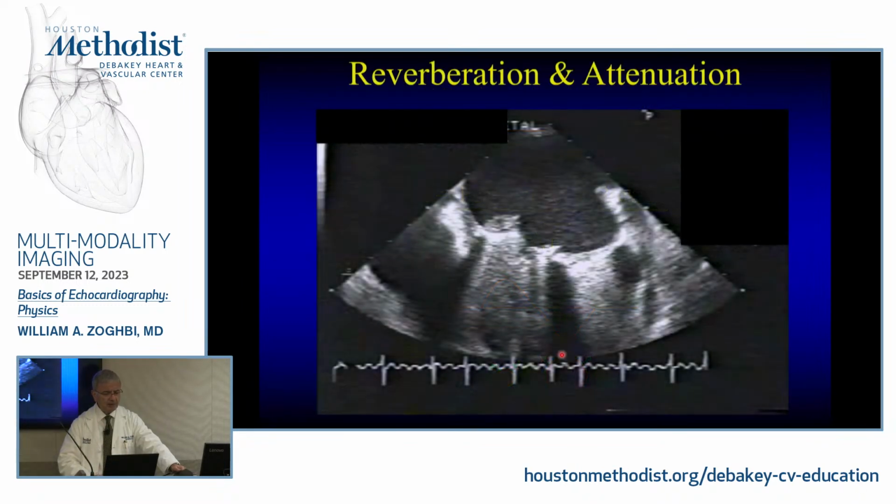contrast is. Now, we talked about, I'm sending these brief bursts of ultrasound. And you have to send brief bursts, otherwise you'll be completely confused.